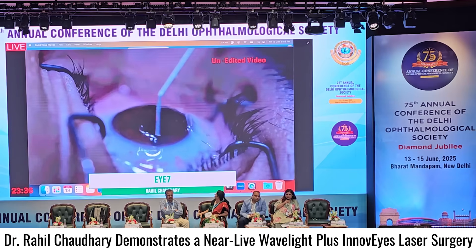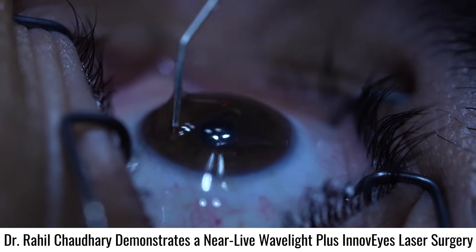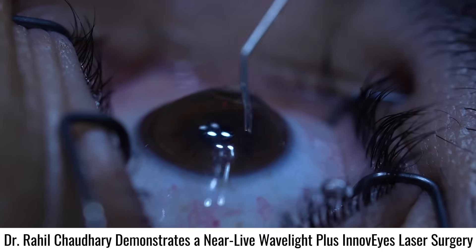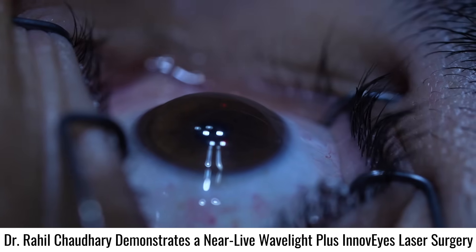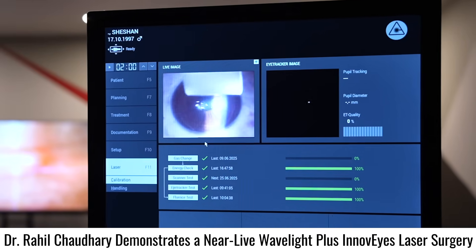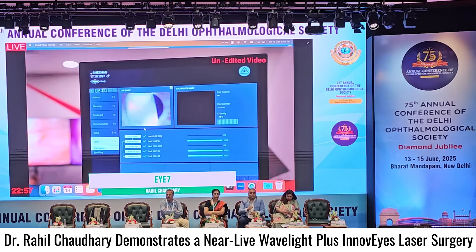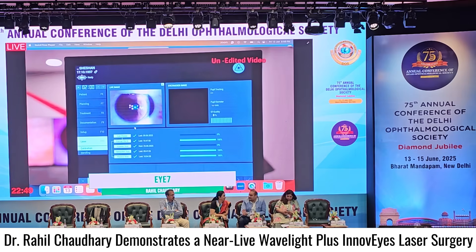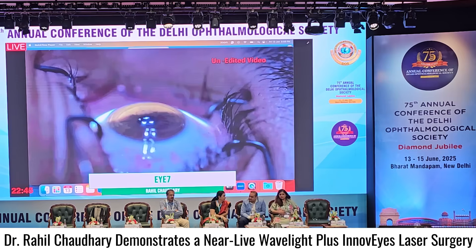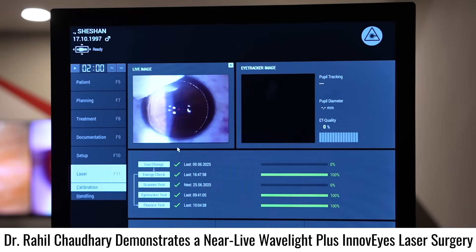Just cleaning the stromal bed — make sure there are no residuals; a thorough cleaning is essential. Repositing the flap back. The flap is nice and perfect. With these newer second generation femtosecond lasers, the quality has really improved, and flap-related complications during the procedure have become zero. This is really amazing — how technology has upgraded. Light ironing with the merocel sponge, making sure the flap is nice and centered in place. These newer flaps with perfect angles, centration, depth, and stromal beds have really improved the outcomes in modern day refractive procedures.